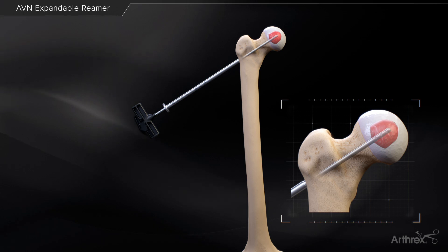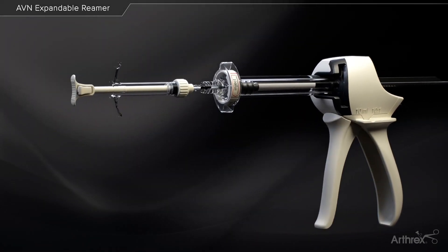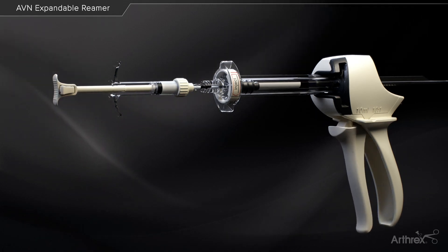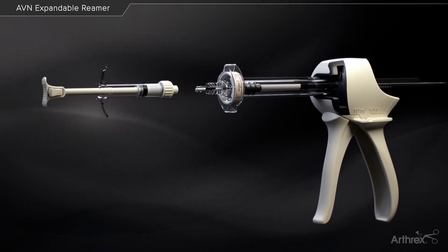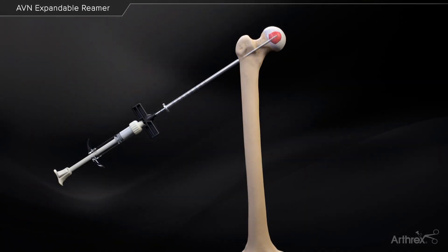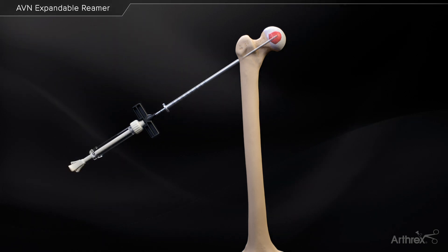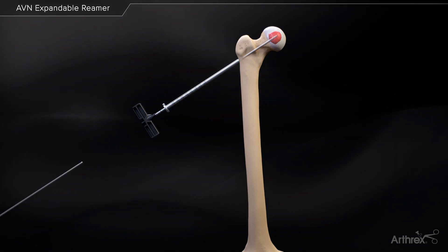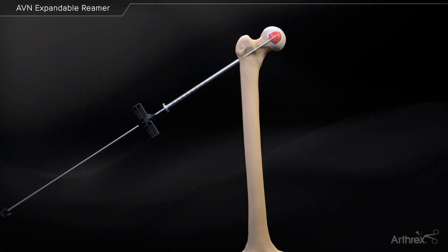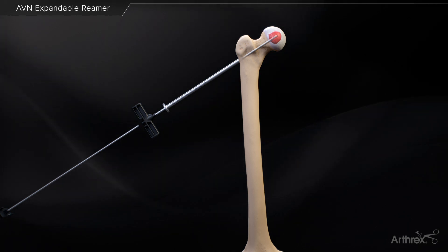Quick-set cement can be used to backfill the rest of the remaining 5 mm socket. To reduce the chance of overpressurization during delivery, transfer the quick-set into a mixing and delivery syringe. Slowly inject the quick-set cement into the delivery cannula until the syringe is empty. The inner stylet can then be used to help deliver any additional quick-set cement that remains in the drill sleeve.